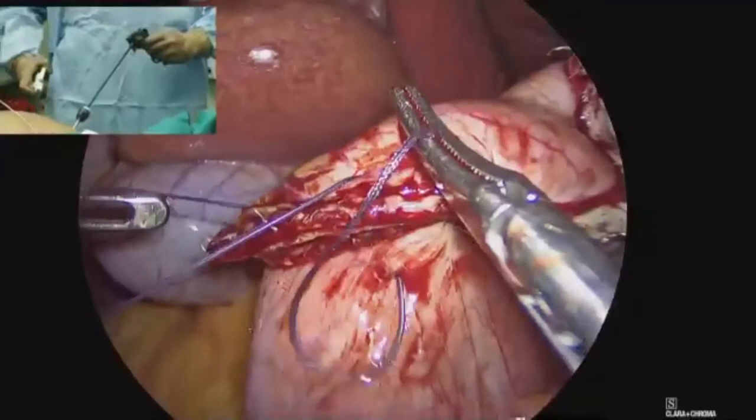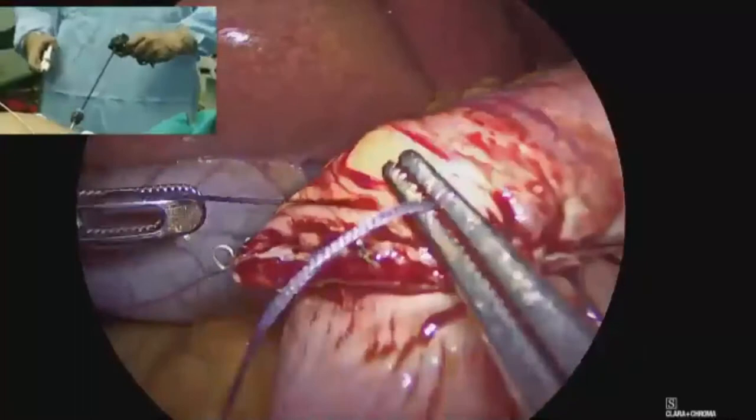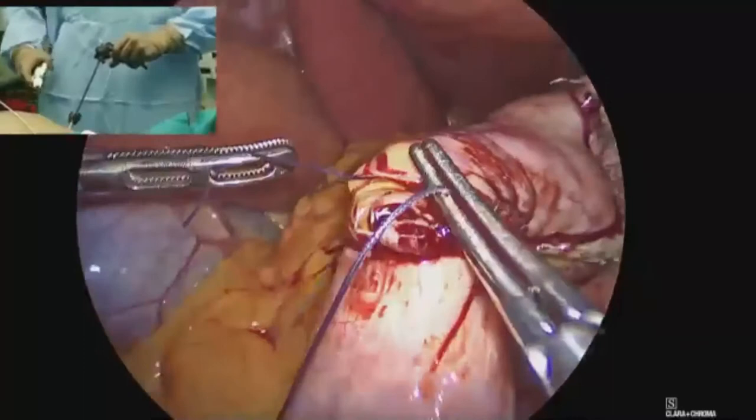So the findings are so different when you see them intraoperatively on a laparoscopic visualization, and that changed the entire course of my way of dealing with that patient, and I had to change the procedure from a bypass to a sleeve because that was a bad liver. I took a biopsy of the liver and then changed the procedure. The port position is a little challenge.